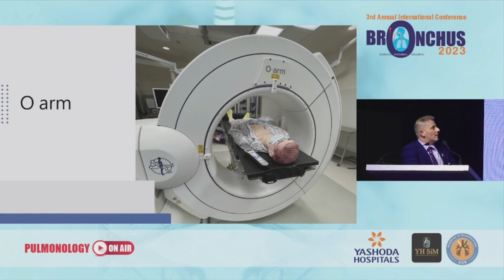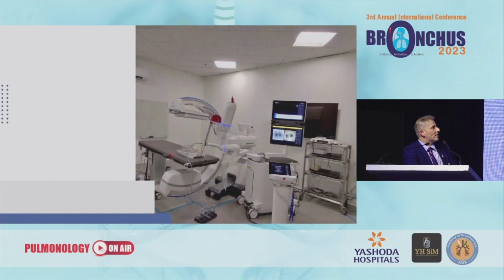3D portable imaging, one of them is the O-arm, which is a platform that most hospitals have. As you see from this picture, it is very important to know where you are setting up your O-arm with the patient, because the height of the bed is very important to start with, the level where you can adjust the O-arm up and down, and the movement in and out for clearance is also important to start any case with the O-arm.